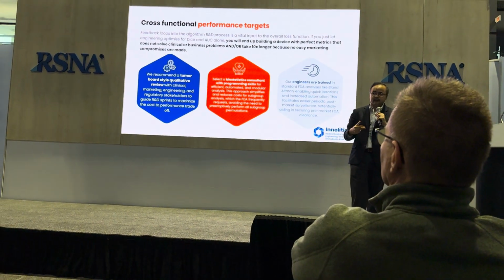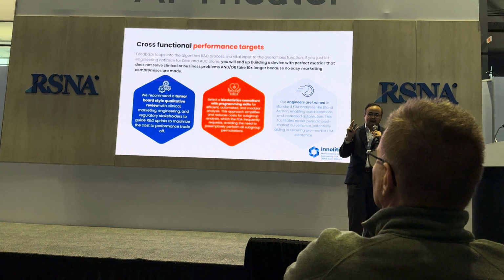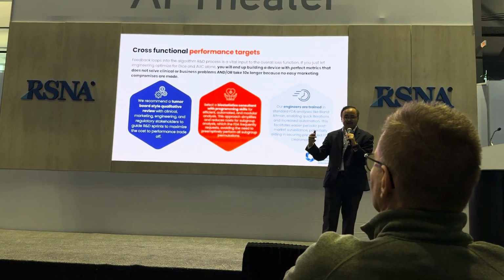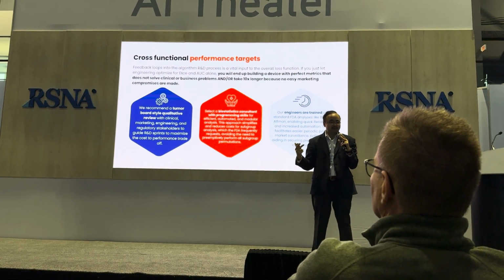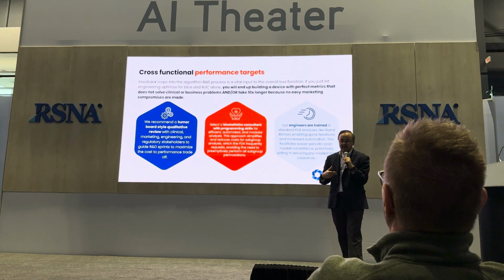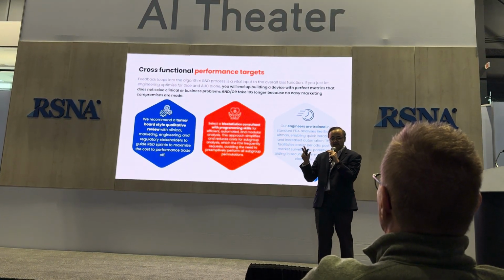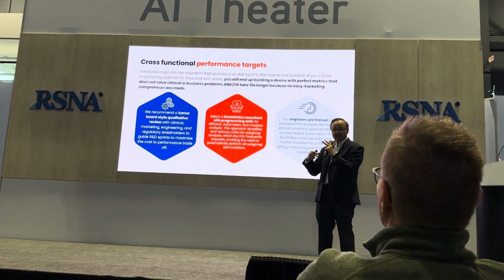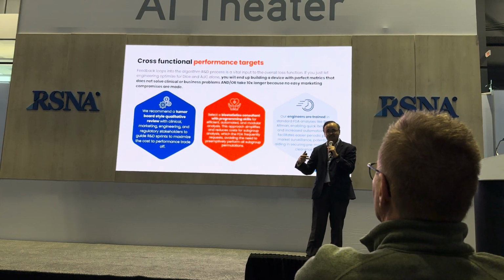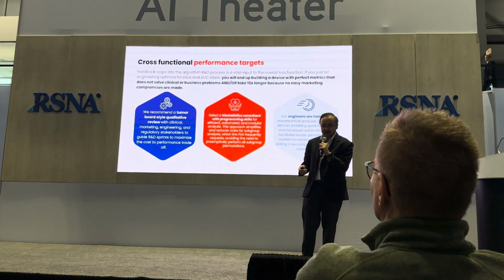For example, if it's important to you to avoid blood vessels, a DICE score of 0.9 might actually perform worse than a DICE score of 0.8 in that case. You won't know unless you look at it. And what we've seen, and we've designed our process to avoid this, is sometimes engineering will be in its own silo. They'll be chasing a DICE score, but in reality you'll end up making a product that no one wants to buy, and you'll end up taking 10 times as long and costing 10 times as much.